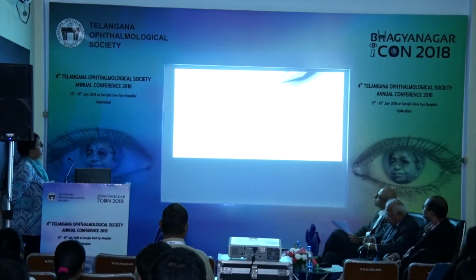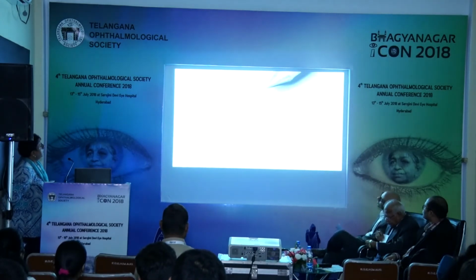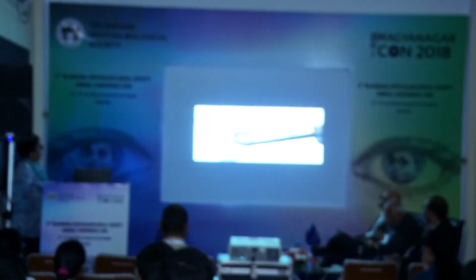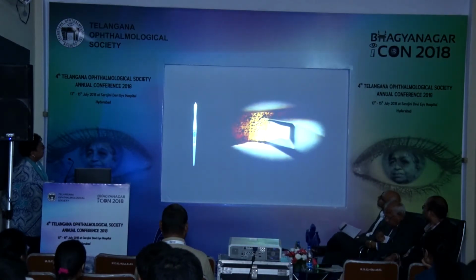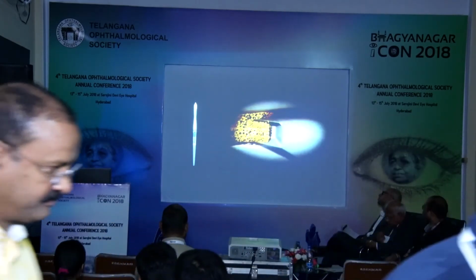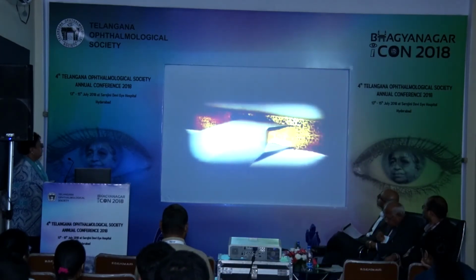The surgical grade stainless steel body is comprised of a long, thin shaft that allows for access across the anterior chamber, a pointed tip used to pierce trabecular meshwork under gonioscopic view, a ramp that lifts and stretches the tissue as the device is advanced, and 2 blades to produce simultaneous incisions in treated tissues.